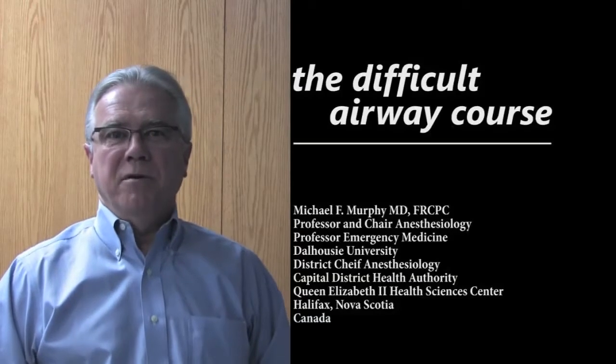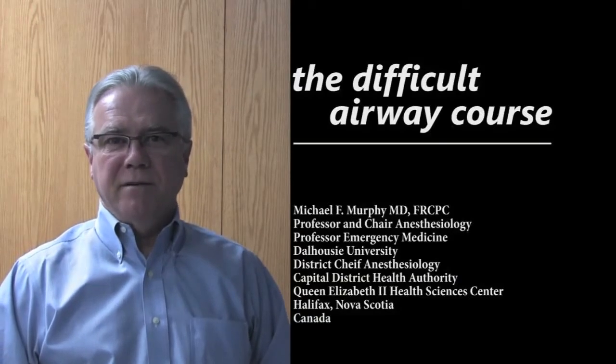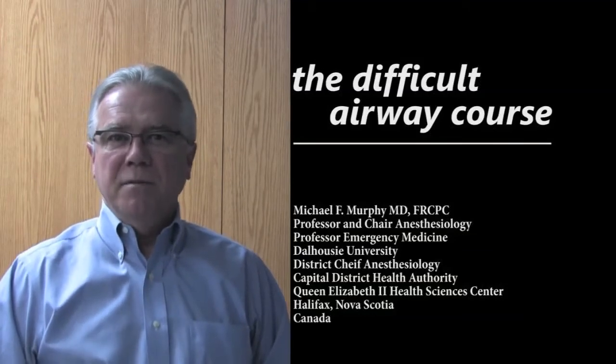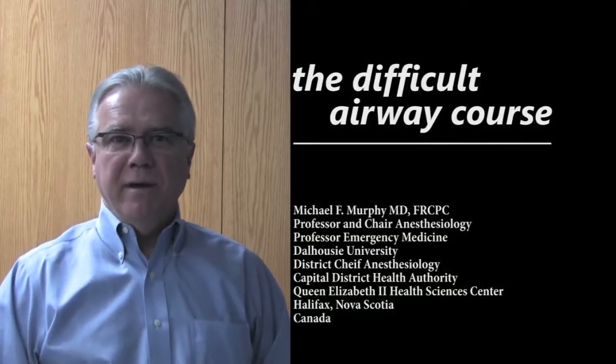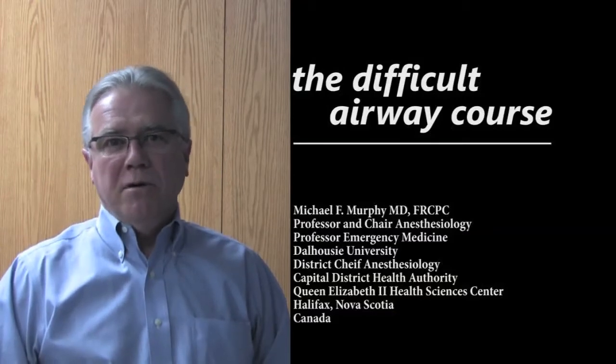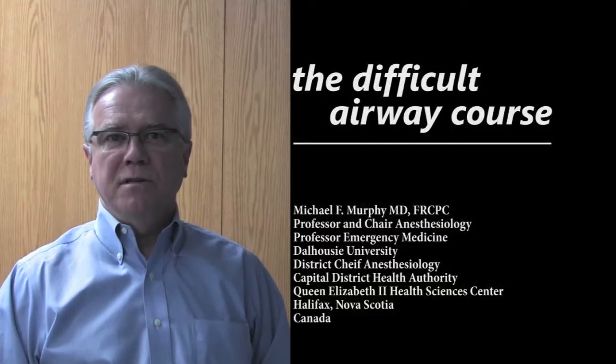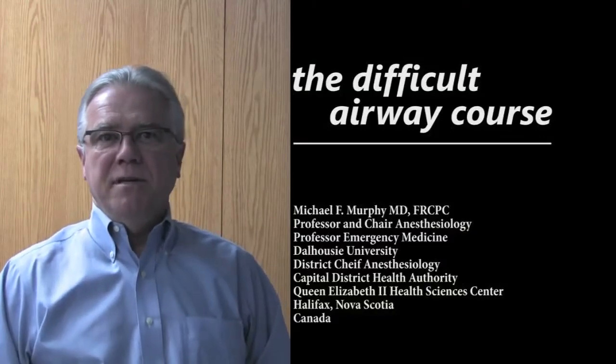My name is Dr. Mike Murphy, and I'm one of the founding faculty of the Difficult Airway Course: Emergency Anesthesia and EMS. For some years, in order to demonstrate the anatomy that we actually use when we're manipulating airways, I've been doing a self-scope at many of the courses for emergency and anesthesia. And we videotaped the self-scope so that we can use it in other teachings.